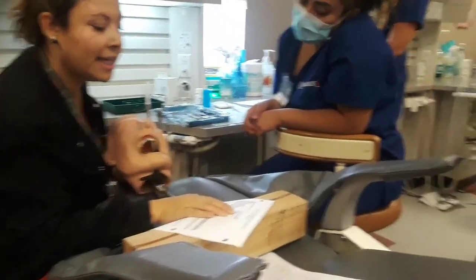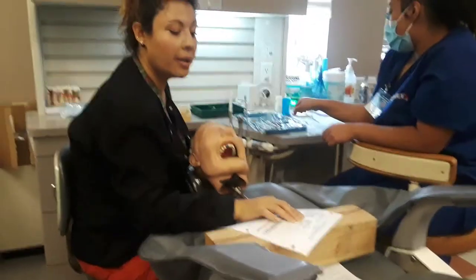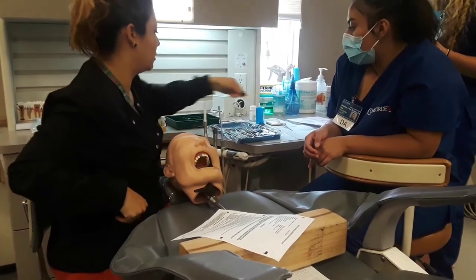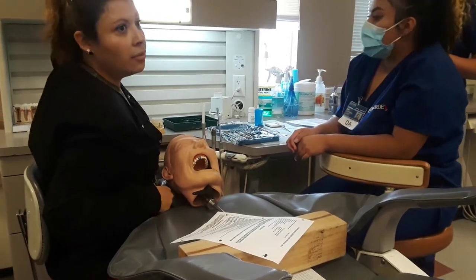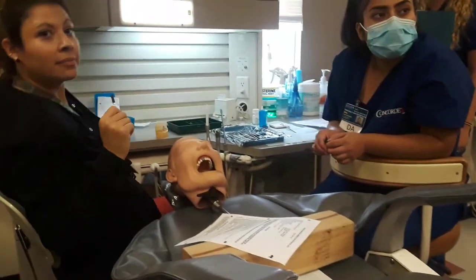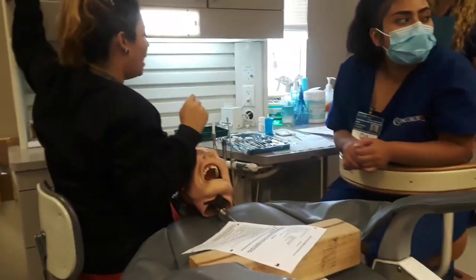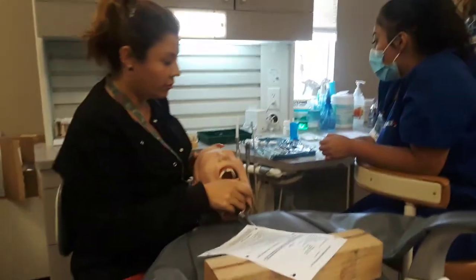We need a mandrel and a lead apron for an x-ray. Why don't you run and get a red ring for me? I'm getting cotton rolls and gauze out also. I'm going to go find the crowns.